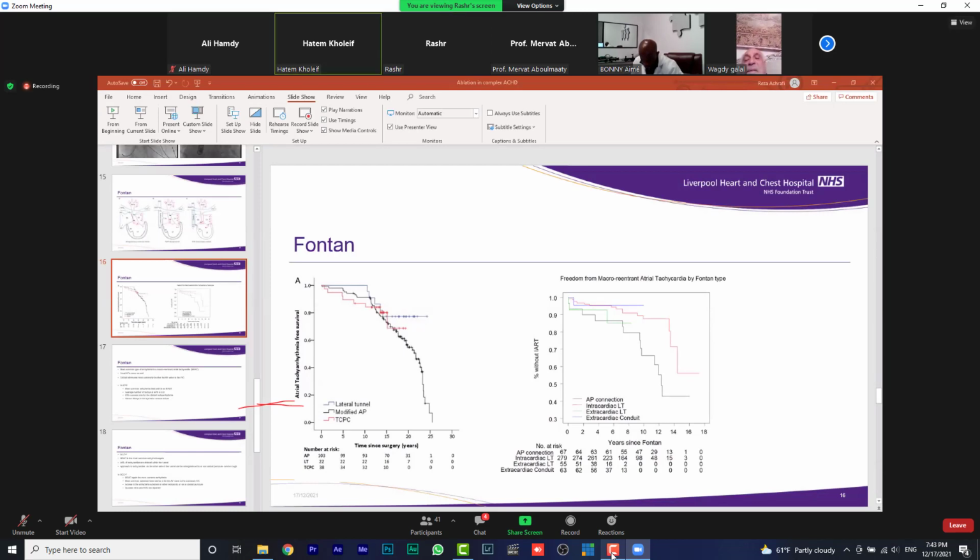I'm asking this because if we could expect the circuit of the tachycardia in Fontan around the scar or so on, is it possible for the surgeon to do prophylactic line by RF ablation following the surgery, connecting this scar with any of the anatomical barriers, to prevent the possible arrhythmias in the future?